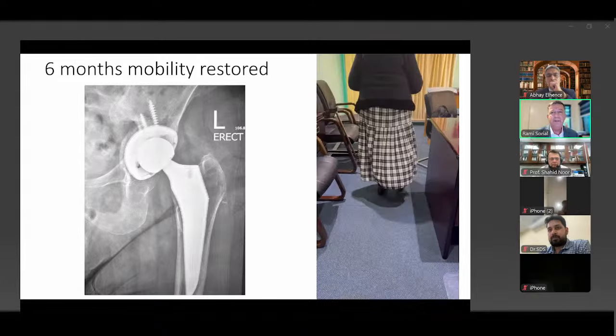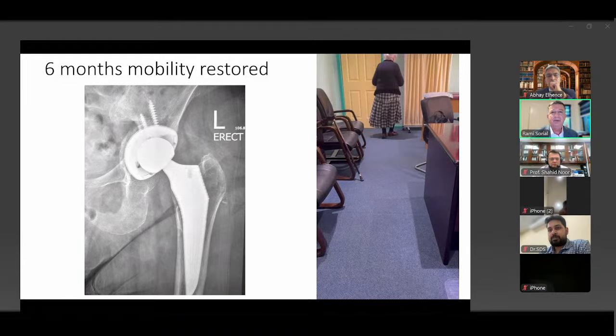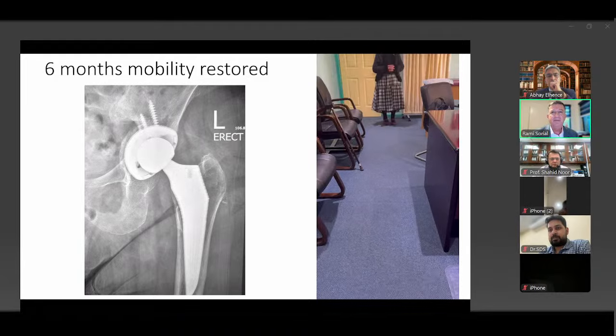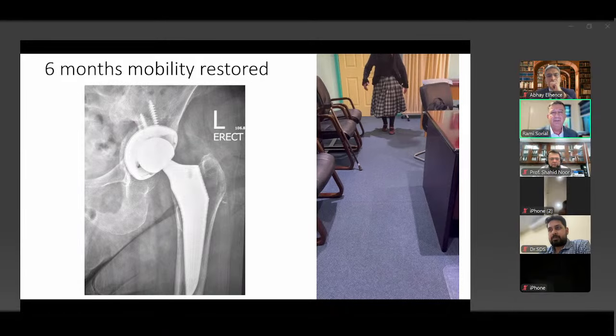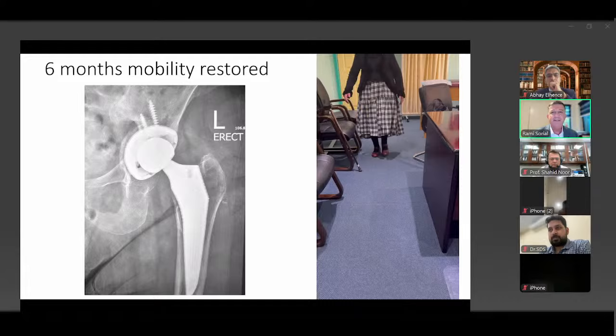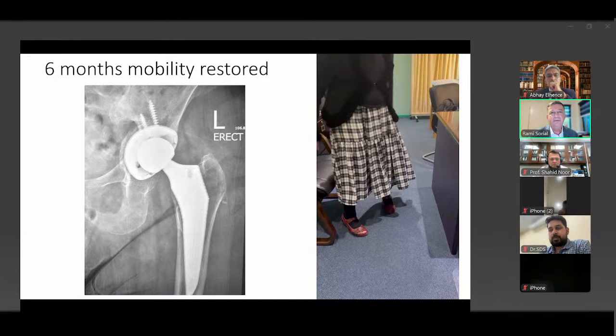She's walking freely, and she's able to execute good balance on both left and right sides to the point where she's happy to demonstrate good mobility, good function, and good stability. That's what you want from a hip replacement in 2025, and three-dimensional balancing helps you achieve that.